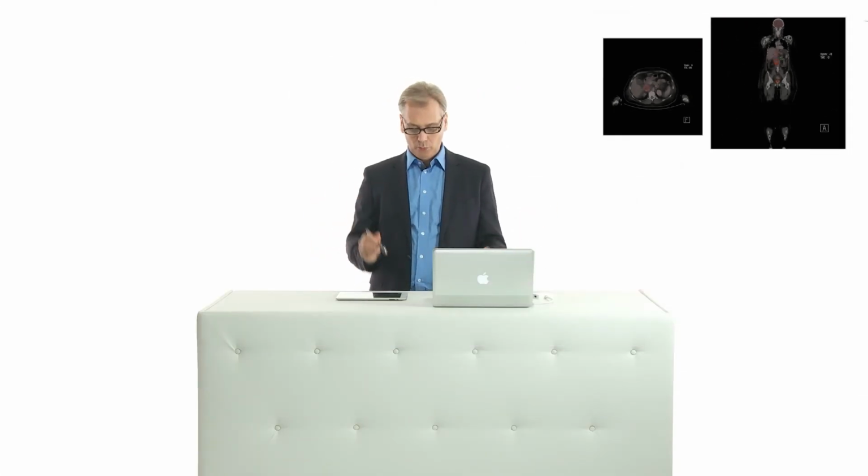Now, what can we learn from this? Well, the subcostal view and the inferior vena cava are important additional views that allow you to look at a number of different pathologies and to estimate even right atrial pressure. Good. Now, this basically concludes this section on the subcostal view, and it also concludes our imaging primer. There are a number of different views that we did not show you here, which you will learn in the masterclass. But for now, I think it's enough.